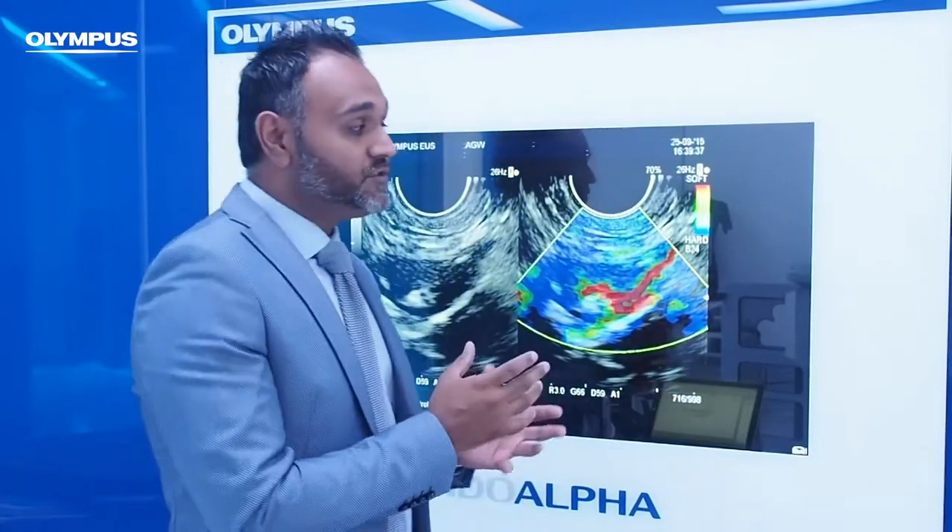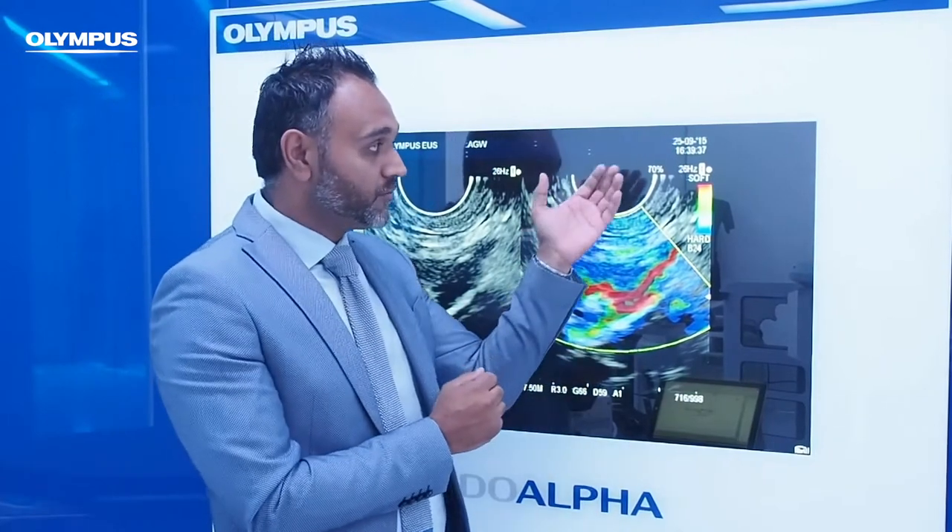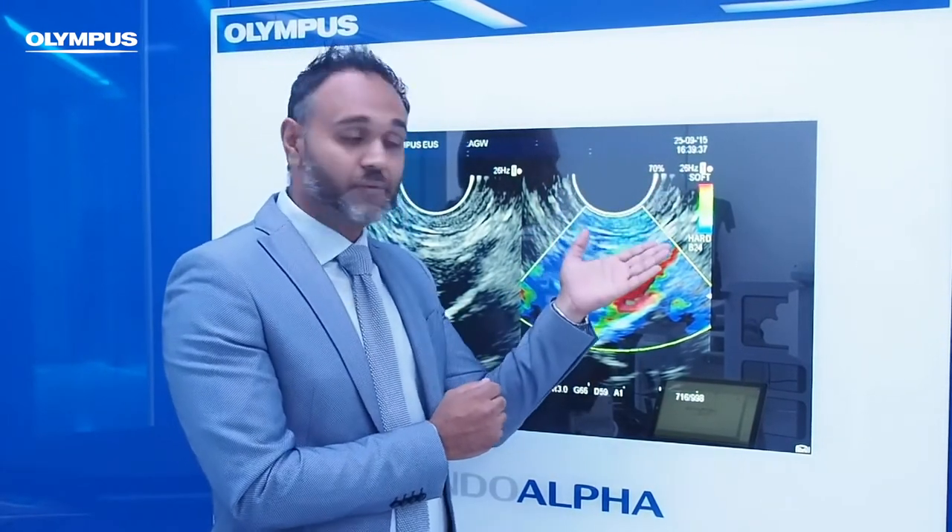How does elastography work? The best thing about elastography is that it provides you with a real-time analysis of your target lesion. It gives you a colour map overlay with a range of colours, from red being the softest and blue being the hardest.